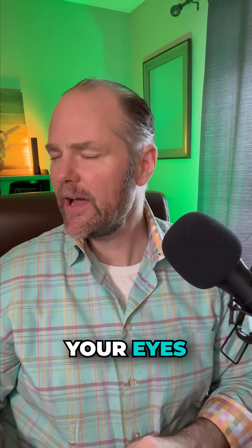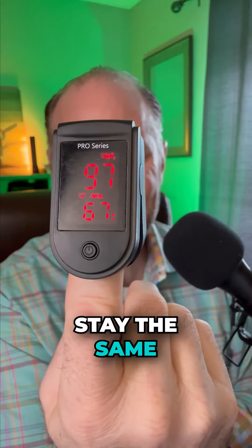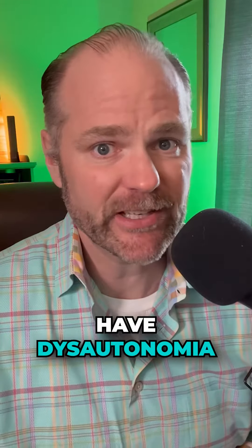How do we do that? You're going to close your eyes and move your head back and forth 10 times, then check the meter. The meter should roughly stay the same. You can see here my pulse is 67. If your pulse goes up more than 10 points, that tells you that you possibly have dysautonomia.